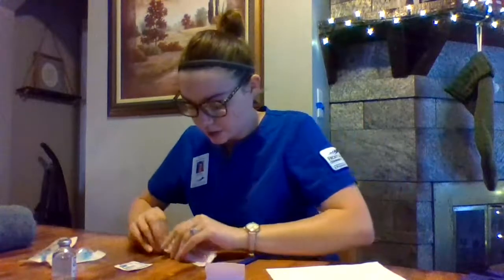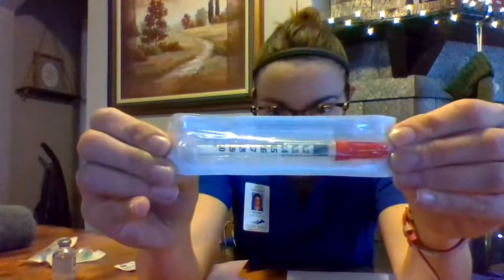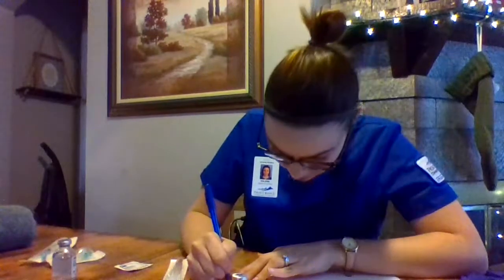I'm going to choose a syringe. For this, I'll be using a heparin or a tuberculin syringe. So this little guy right here. I'm going to fill out my label. So I have Fanny Fundamentals 11355 receiving heparin, the 1 in 10,000 strength, 1200 units subcutaneous, which is 0.12 milliliters.